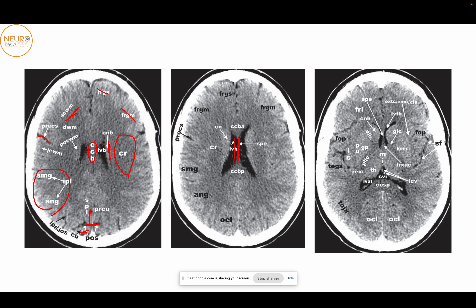At this level, you have the lateral ventricle bodies forming the frontal horns on both sides and the atrium on both sides. This is the corpus callosum anterior body and this is the corpus callosum posterior body. You have the caudate nucleus lying lateral to the lateral ventricle and the corona radiata. As we come down more inferiorly, the lateral ventricle is forming the frontal horn and the atrium. In relation to the frontal horn laterally, you will have the caudate nucleus head, and in relation to the atrium posteriorly, you will have the occipital lobe.